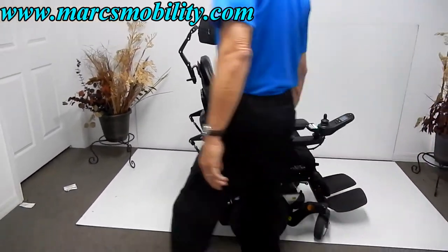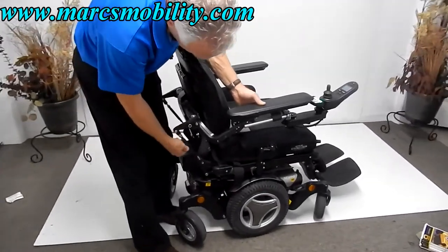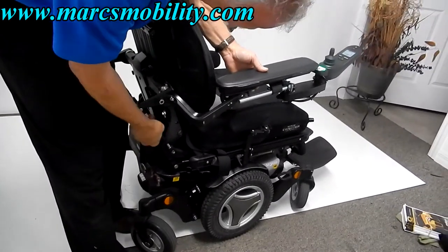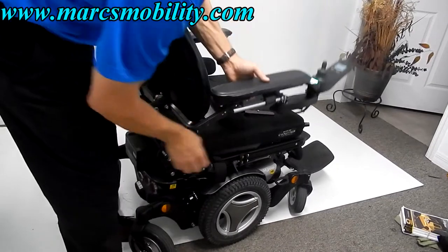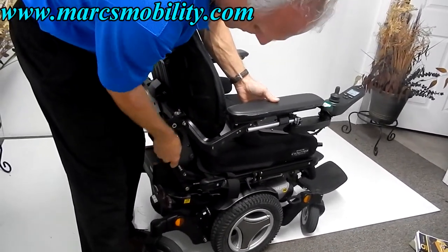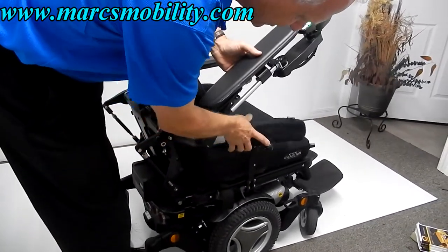If you need to adjust the arms, there's a cylinder here — unscrew it and you can turn it. As I go down, you can see the arm going down; as I go up, you can see the arms going up. So these arms are adjustable to whatever height you want on this chair.